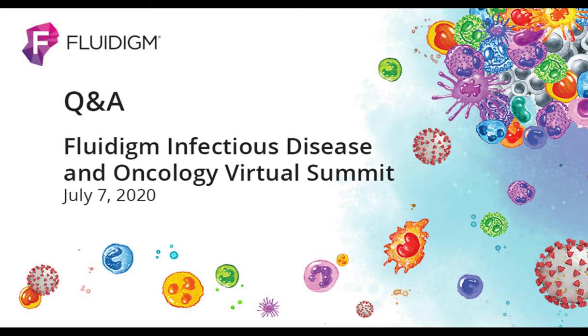Shelley, do you want to maybe address this? Sure. Yes, we worked in collaboration with another lab here at WashU, and they did test it on live virus and said the 90 degrees was great at inactivating it. We had previously used 56 degrees at 30 minutes, but we found this 90 degrees at 10 minutes worked even better.